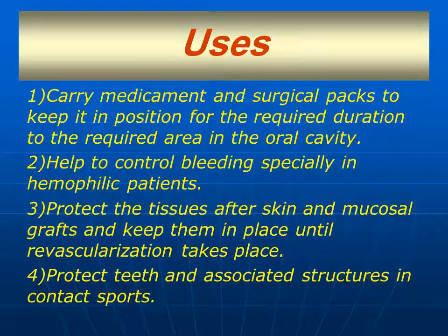Uses. Stents are used for many purposes. First, they carry medicaments and surgical packs to keep it in position for the required duration to the required area in the oral cavity. Second, help to control bleeding, especially in hemophilic patients.